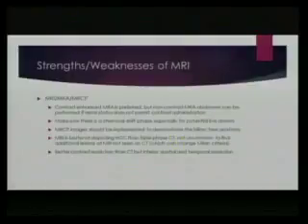You need to do MRI, MRA, and MRCP. The MRCP is to evaluate the biliary structures. MRA, of course, is to look at the arterial anatomy. I still feel personally that CT, when you can use the hepatic venous and portal venous phases, gives you a better look at the venous structures than MR. I like the spatial resolution of CT for that.